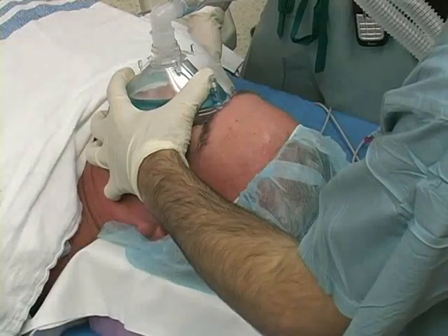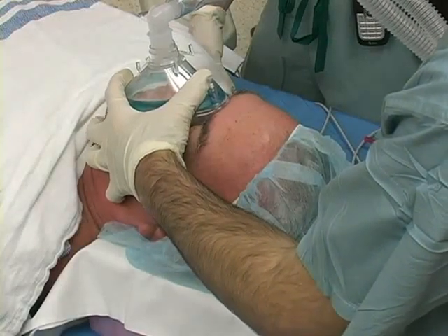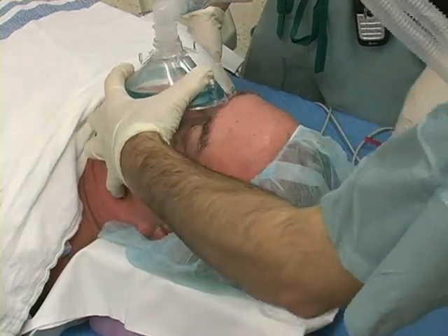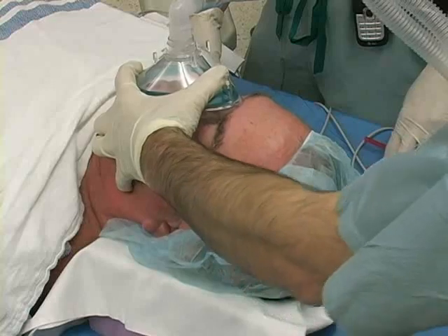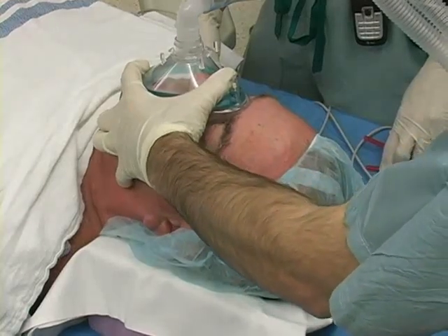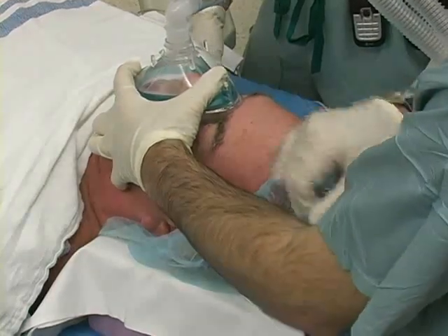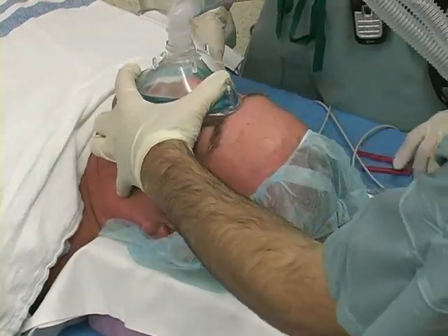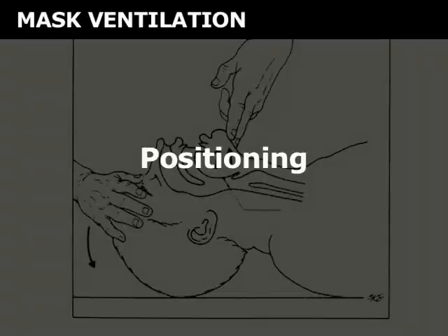At this time, it is appropriate to give the patient medication to induce general anesthesia. Watching the patient closely, examine him or her for signs that he or she is no longer conscious. This includes the loss of the lash reflex, loss of response to verbal command, and apnea.